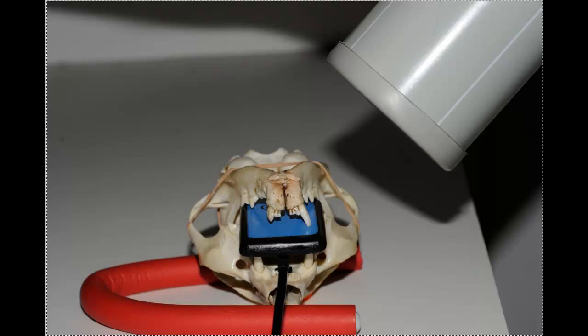And of course, to do the other side, we simply switch this over. We don't have to move the subject at all in this particular instance. And again, we have teeth close to vertical, approximately horizontal on the sensor. And our bisecting angle would be like so.